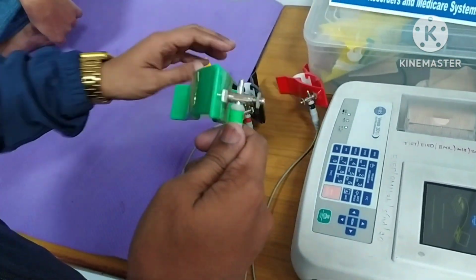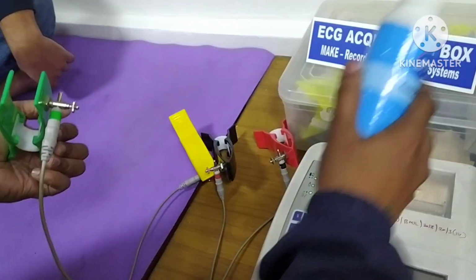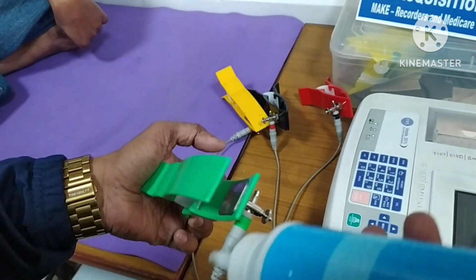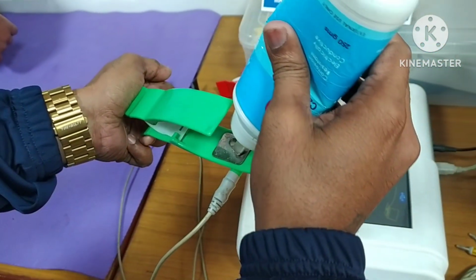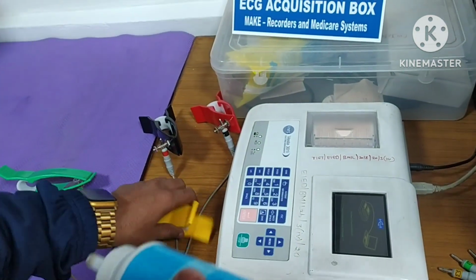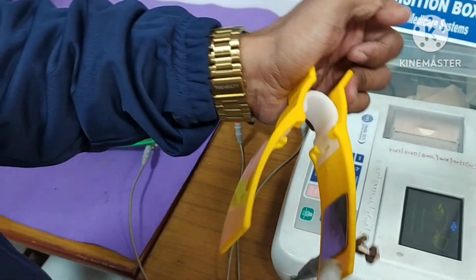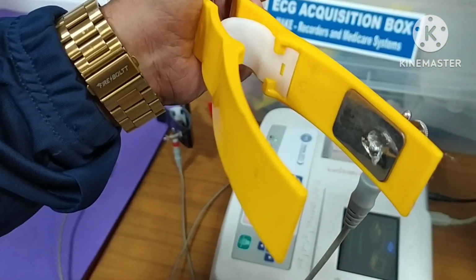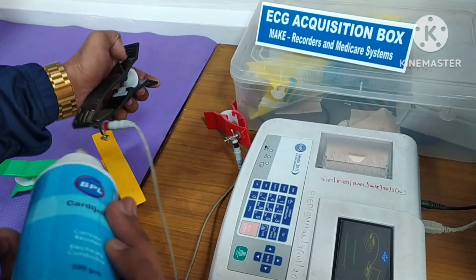So before connecting these electrodes to the patient or subject, we need to apply conducting gel on each electrode, like this.